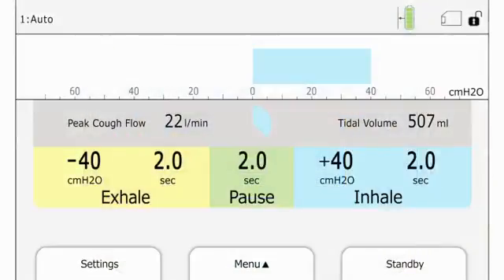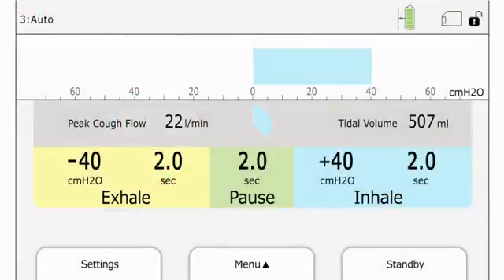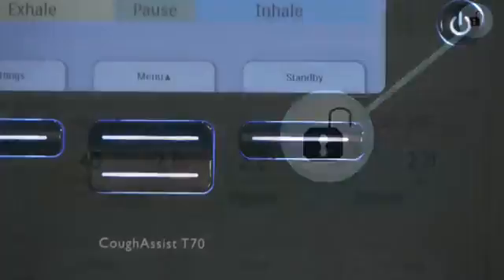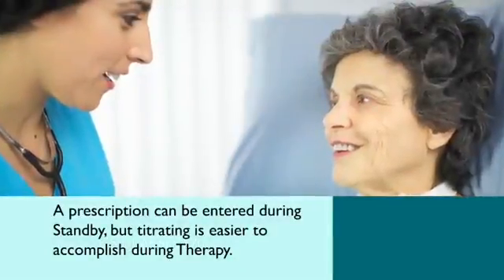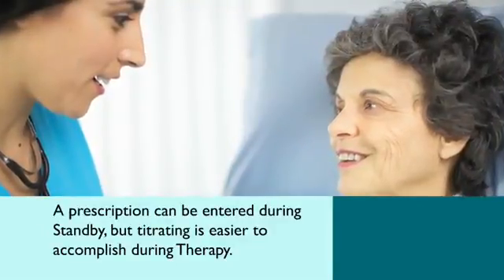3 unique prescription settings can be stored in CoughAssist T70, so you can quickly select treatment pressures based on a patient's current needs. On the upper right-hand side of the screen, if you see a small open lock icon, you will be able to make changes to the settings. Changes can be made to the settings during standby or therapy. A specific prescription can be entered during standby, but titrating is easier to accomplish during therapy.